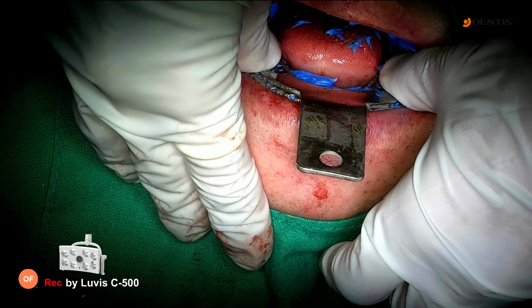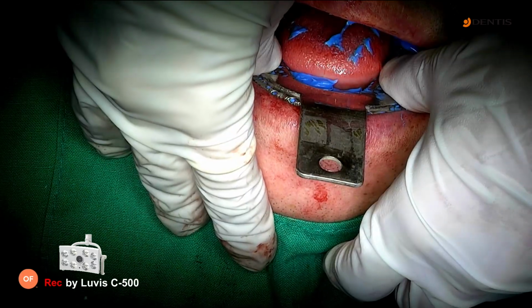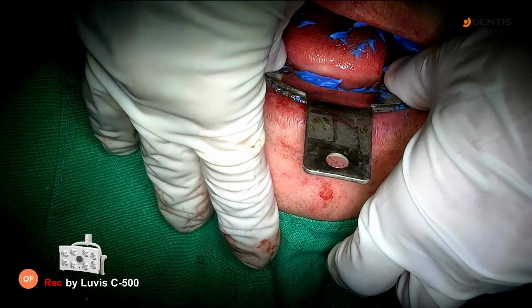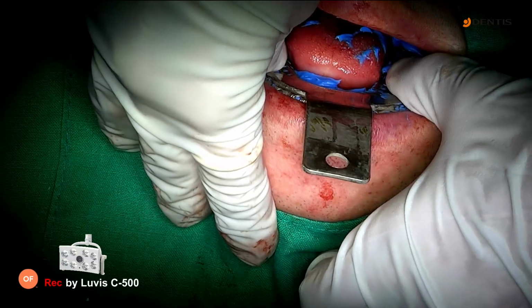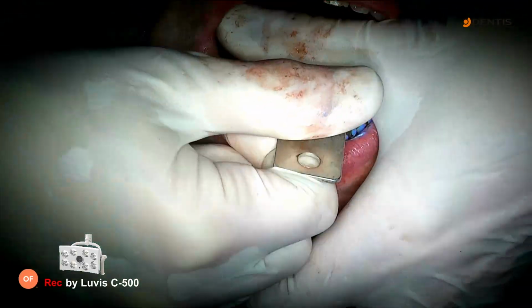This is before surgery. I make a putty, we just call it putty index, P-index. This is the upper jaw and the lower jaw. And then this is the 4 hours. I make an immediate denture. And then this is the putty index before tooth extraction. So with this one, I want to maintain the vertical dimension. Okay?